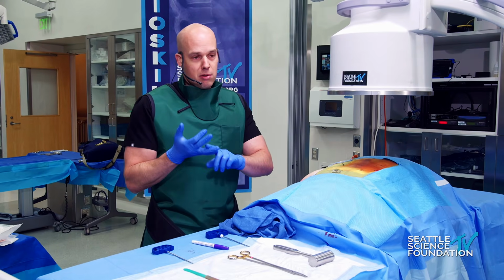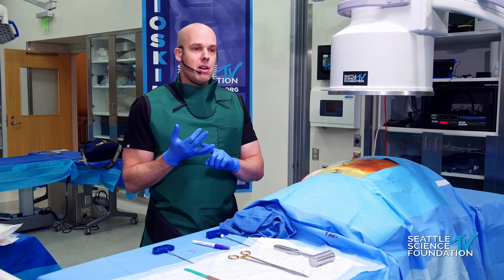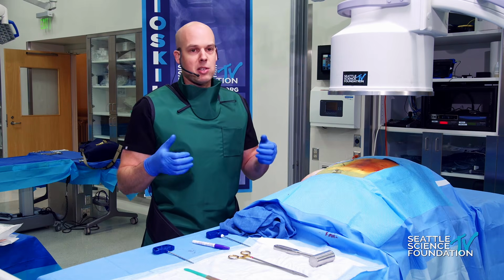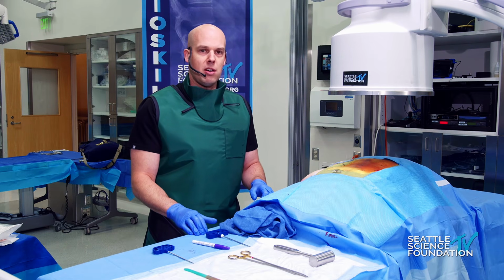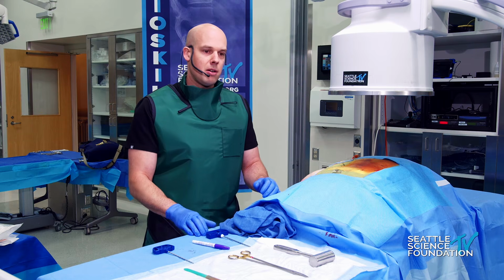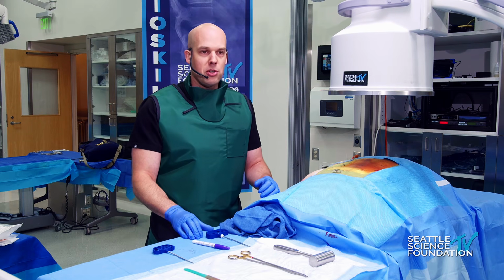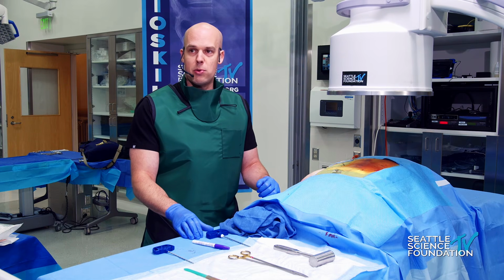Sometimes those fractures may have split, so the A2 type, either sagittal or coronal, or a complete burst that, for the skilled practitioners, we can treat as well with either kyphoplasty or more and more with third-generation augmentation techniques such as SpineJack. So we'll review that as well.